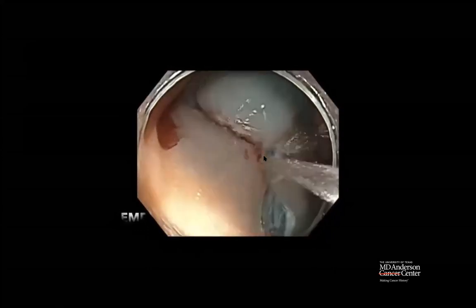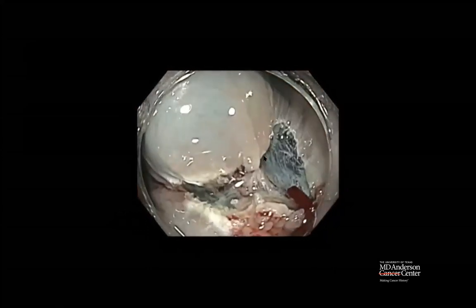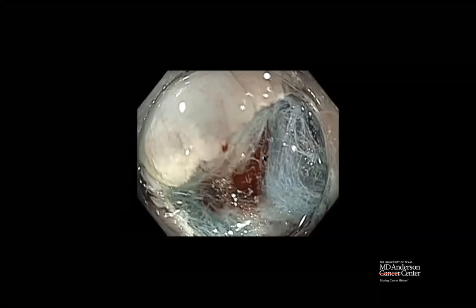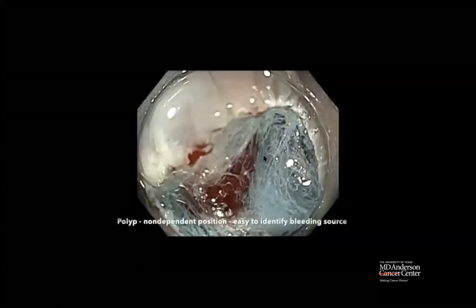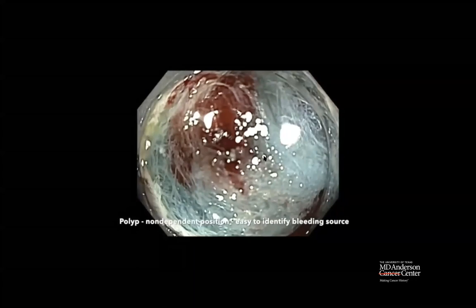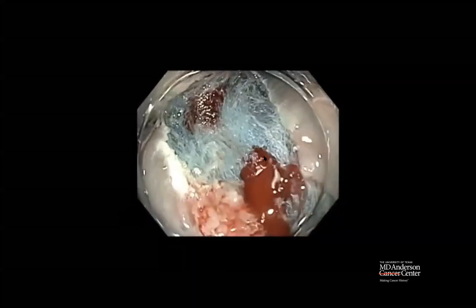I did an EMR, and then there was bleeding. So you could see the bleeding spot nice and easy because it is not in a dependent position. I used the cap to apply a little bit of tamponade effect while I was getting my hemostatic forceps.